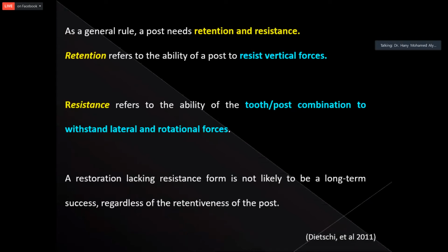In general rules, the post have two requirements, have to provide the retention and resistance. Retention means the ability of a post to resist vertical forces, and resistance is referred to ability of the tooth and post combination to withstand lateral and rotational forces.